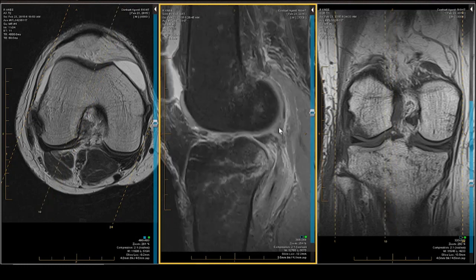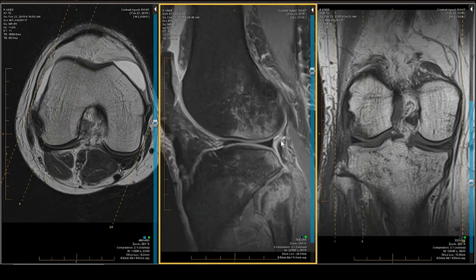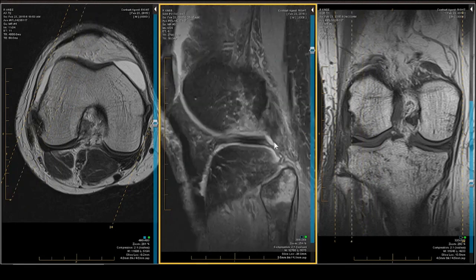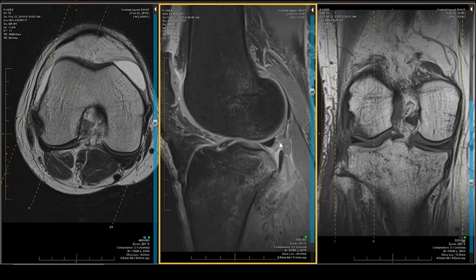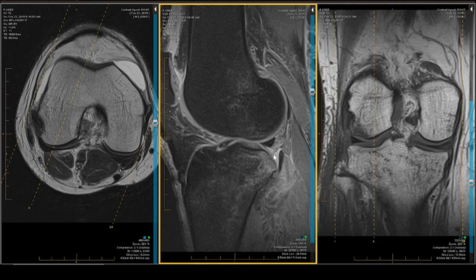The posterolateral meniscus has an upper attachment and a lower attachment forming its hiatus, running from superficial to deep. The superficial attachments are still present. However, going deeper toward the midline, the meniscus appears to float — the inferior attachment of the lateral meniscus has come undone from the fractured posterolateral tibia. This is usually not problematic on its own, but we have much bigger fish to fry in this case.